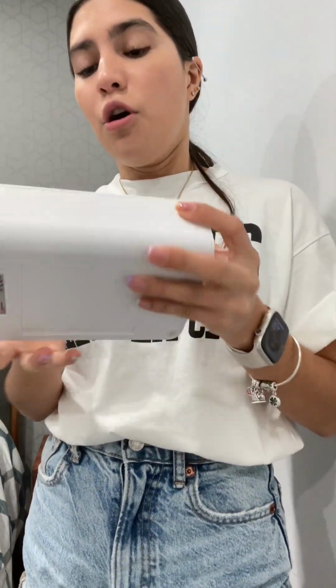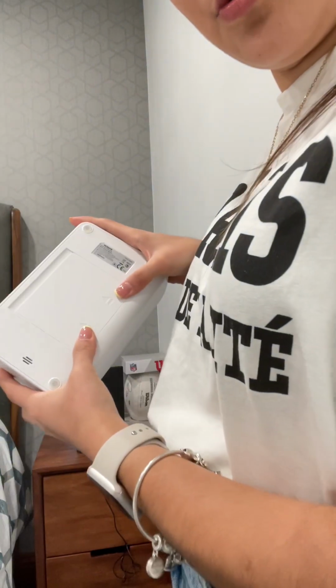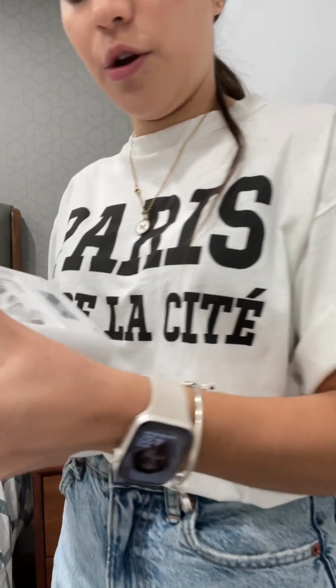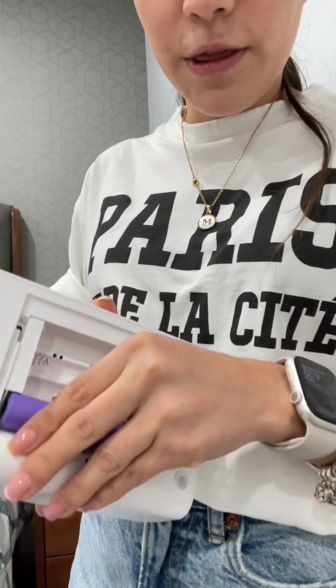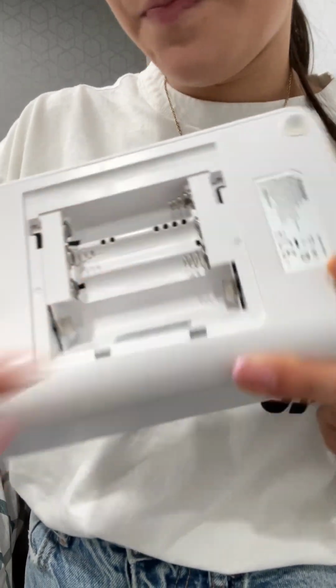Okay, now to the power modes this pressure monitor has. It has 3 different types of power mode. The first one is with the lithium battery that I'm going to show you. You need just to swipe this like this, and you can put here the lithium battery. Okay, like this.